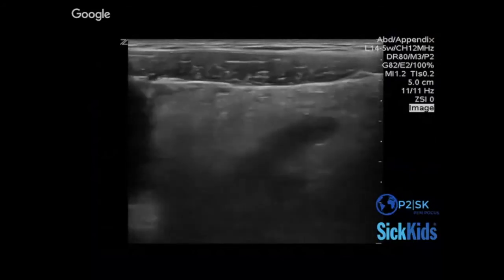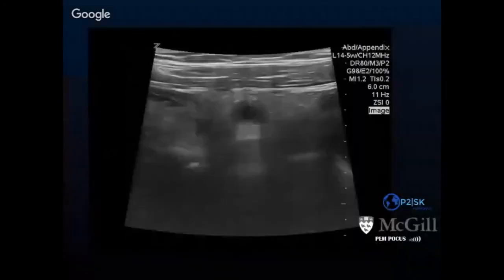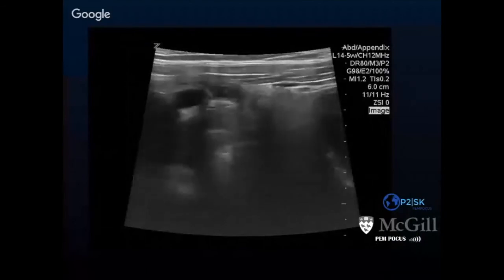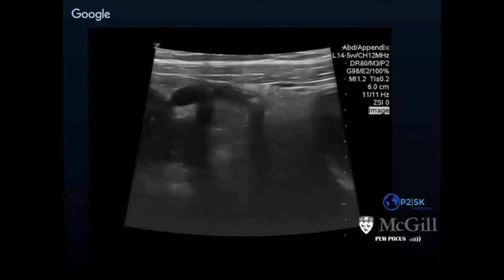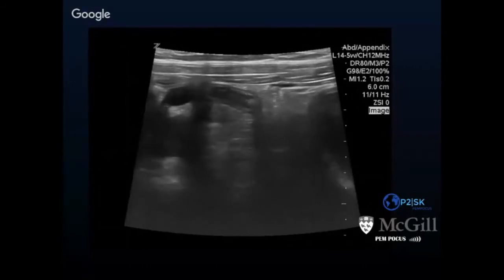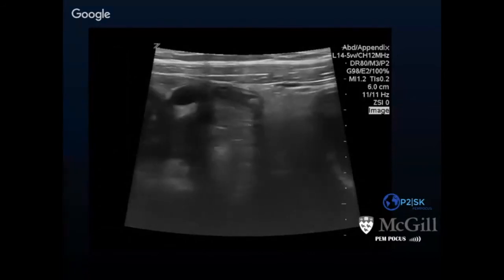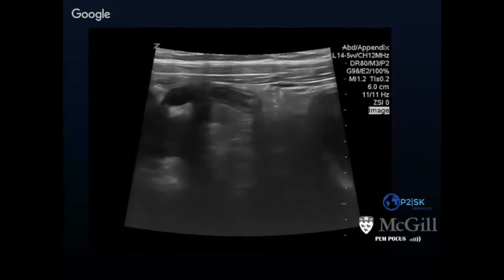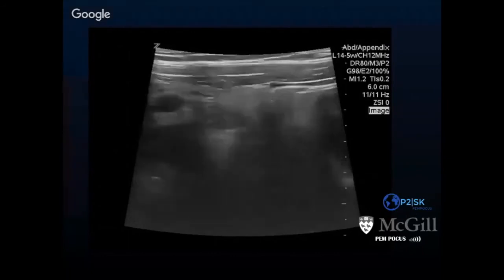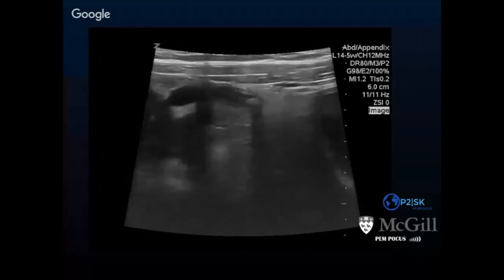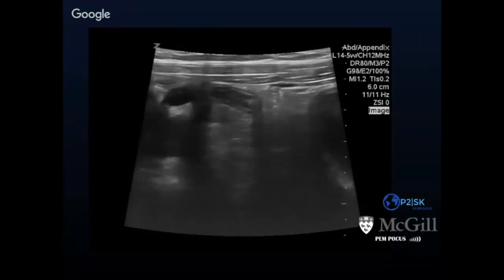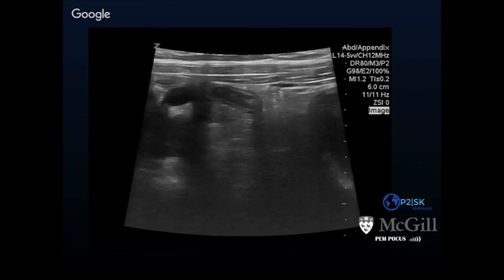And here, you can see fat on the right of the screen, and towards the end of the clip there is a hyperechoic round area with a clean shadow beyond it — that's suggestive of an appendicolith contained within an inflamed appendix, and is suggestive of appendicitis.